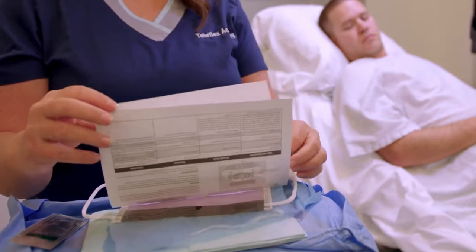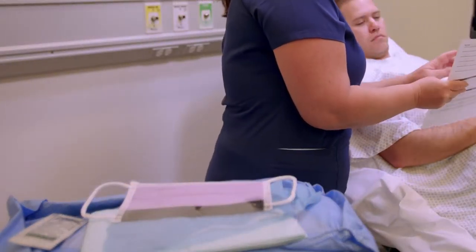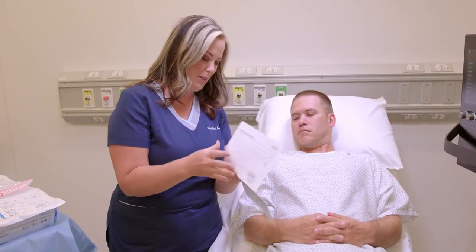Instruct the patient with an information booklet that will be left at the bedside, describing the midline and explaining the care and use of the midline catheter. Advise the patient to take it home if they will be discharged with the catheter.